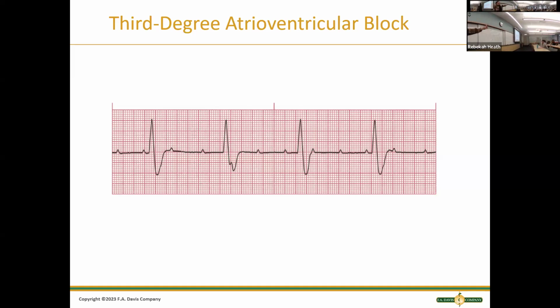All right. Somebody who's in a 3rd-degree heart block, if we see somebody with that, they are sick. Because what's the heart rate on this patient right now? 40. And when your heart starts not talking to each other, the different parts, that means you're in trouble. These are patients who usually need like a pacemaker or something to go on. So if you see somebody who's suddenly in a 3rd-degree heart block, we know that's bad news. We need to go check on them, get their vitals, notify the provider, probably prepare them for like some pacing.